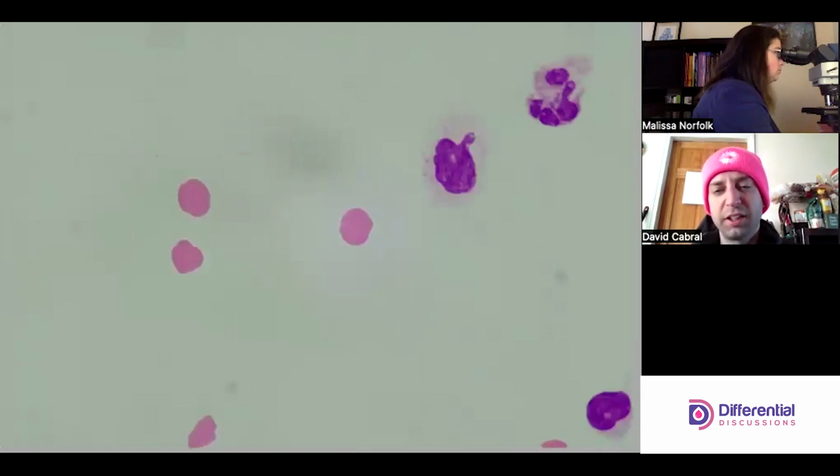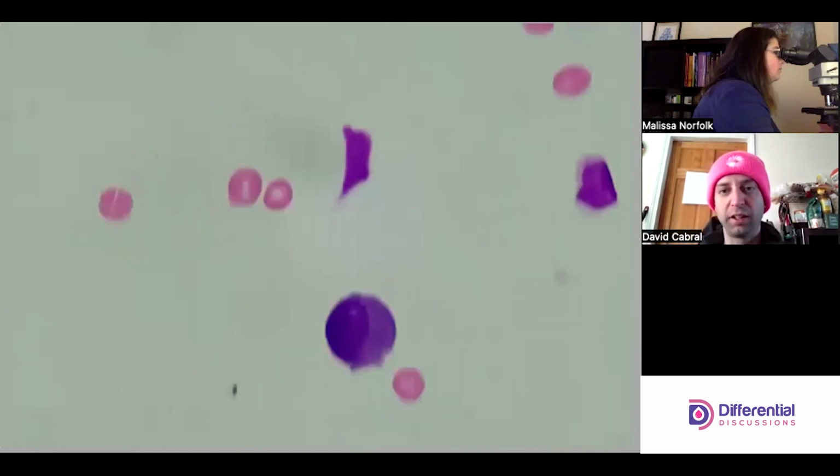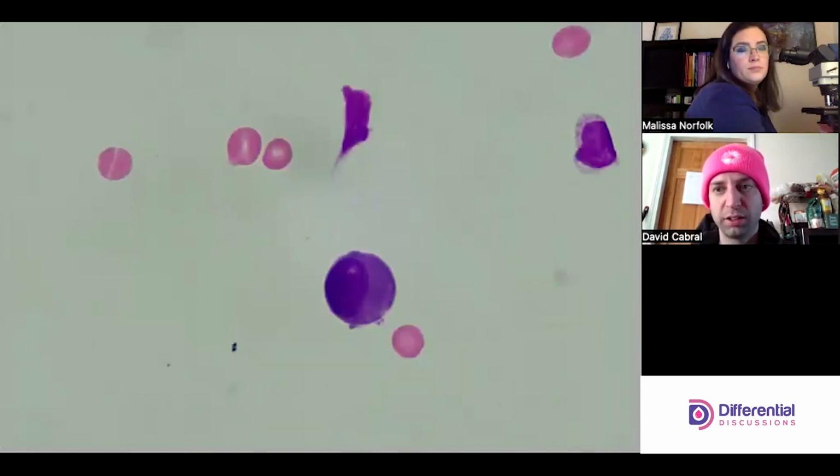And then just a note on its size too. Sometimes the cells don't really splat onto the glass as well, and that might account for the darker colorations and things like that. It's kind of rounded up.